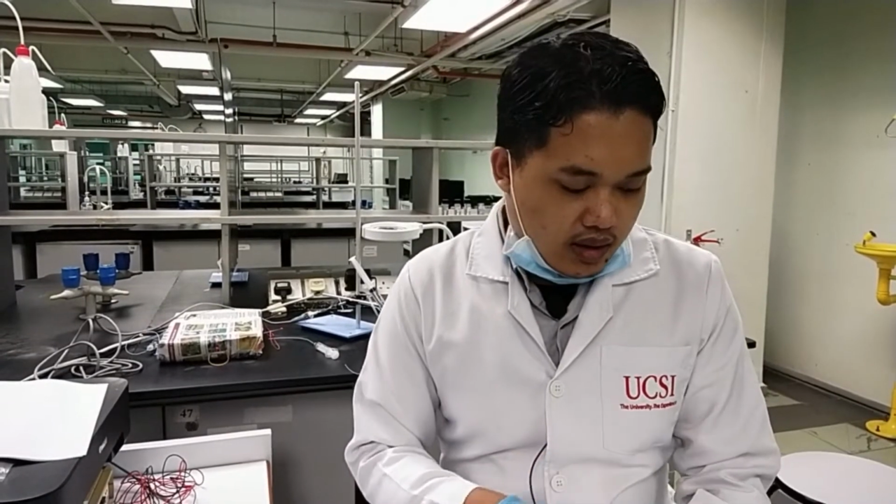After we prepare the animal, we proceed with the methodology, where we study the effect of vagus nerve stimulation and also the effect of various types of drugs. So without further ado, we are going to proceed with the animal preparation.